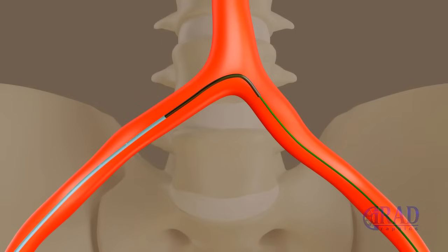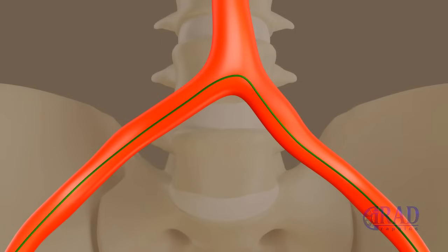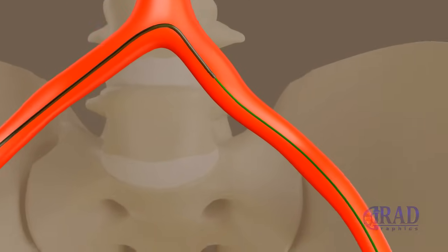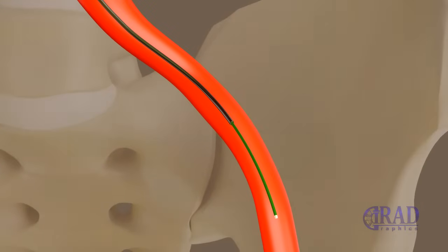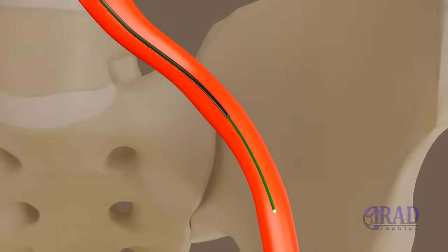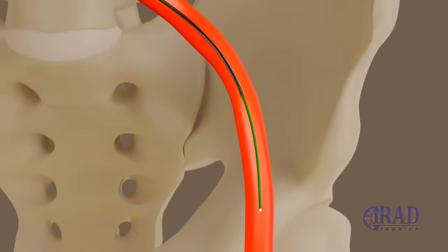Subsequently, the curved catheter is exchanged for an angled catheter. The combination of angled catheter and wire is advanced to the distal contralateral femoral artery.